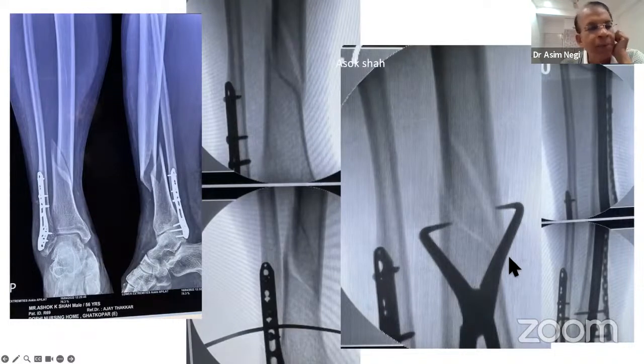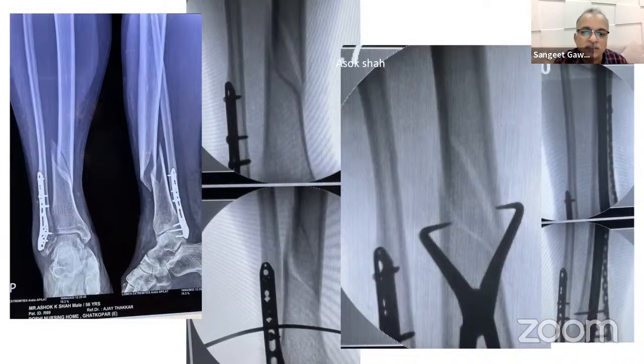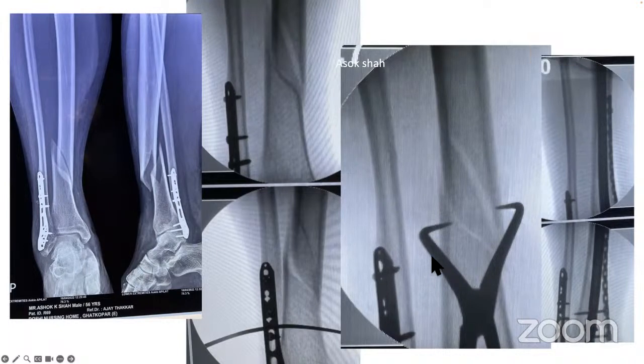Even the Indian companies make nails which have got the option for four distal locks in different directions. They are all within the first 4 centimeters of the subchondral bone. The tip of this reduction forceps has to be strategically placed, understanding the obliquity of the fracture, then only it is going to work. So otherwise, you have to judge how exactly it will be put in there.